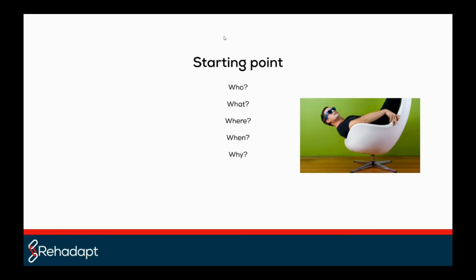So this is where I always start with a starting point: bring yourself into the situation of the beneficiary. When you are someone with cerebral palsy, you are located maybe in a wheelchair or you're located in a bed. So the starting point is always, who is the person that wants to use the tablet system? What kind of tablet system is it? Is it something with a protective cover or without? Is it something that needs to have a different access method? You know, tablet systems nowadays can be controlled by switches, mouse controls, and all of these.